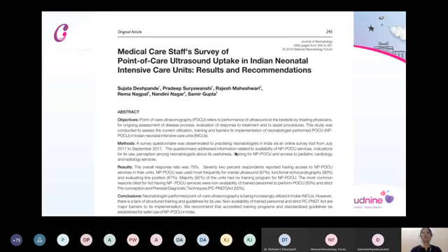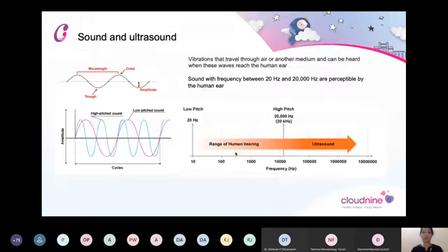Even in these ultrasound workshops that are conducted, every single ultrasound machine that is used needs to be registered, otherwise they can penalize people. So it's very important to make sure that you take care of this registration and whatever needs to be done legally in order to start learning and practicing point of care ultrasound.